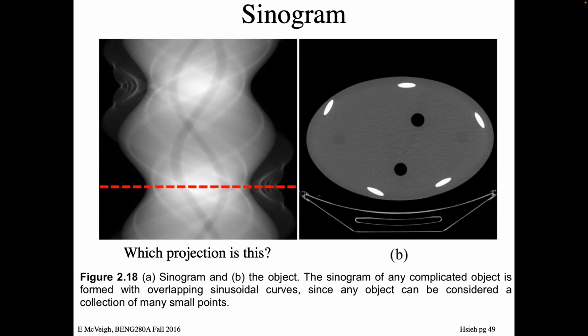If I look at one location in the sinogram, now I have a specific angle defined by this row, and along the detector, this function is what we see. So you ask, what could be the possible angle of projection if this is my sinogram of this object, and I pick this line?